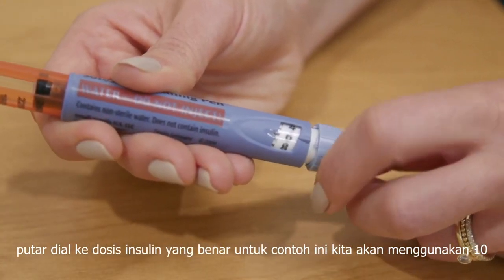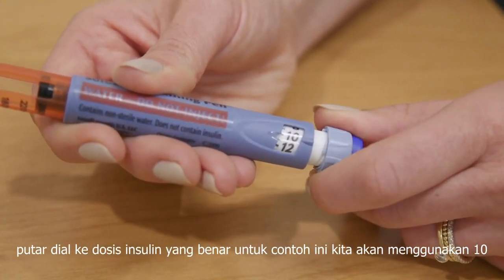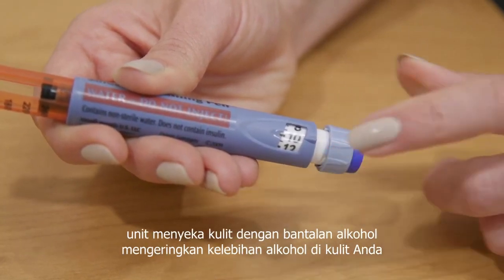Turn the dial to the correct dose of insulin. For this example, we will use 10 units.